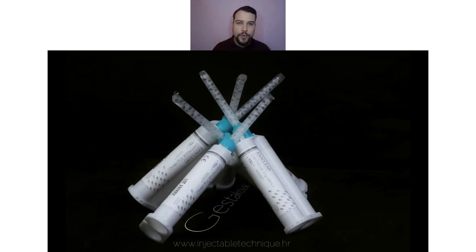And in case something goes wrong, because sometimes you can face problems, if you can see through the transparent silicone, you can fix them immediately or, even better, avoid them.